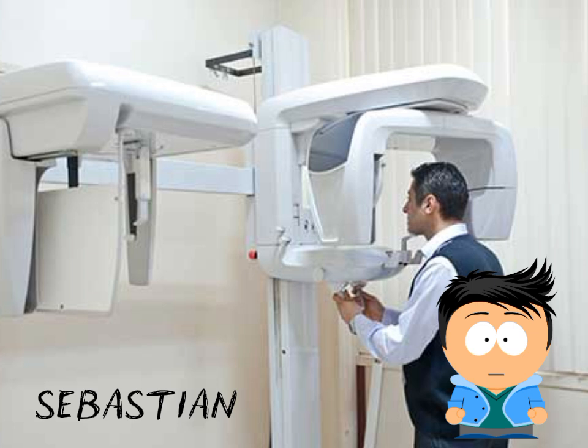Its components are an X-ray tube, a digital sensor, a patient support system, and a control panel.